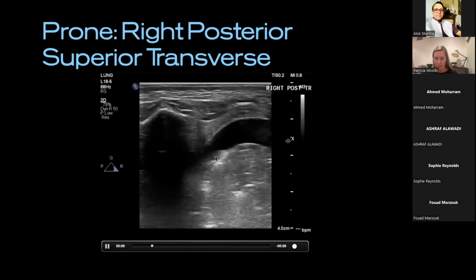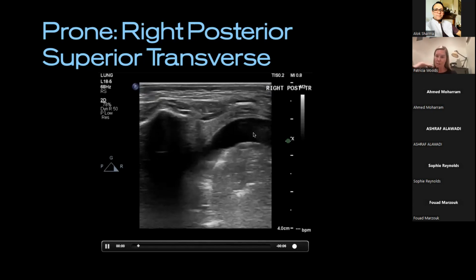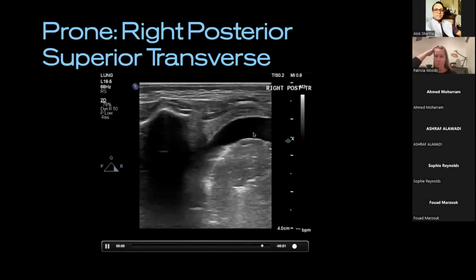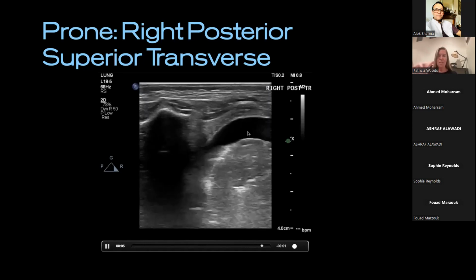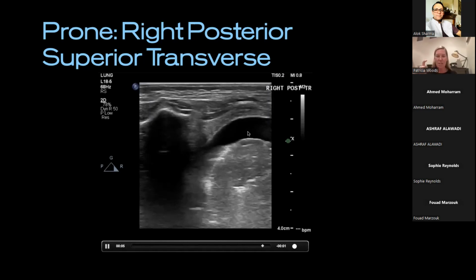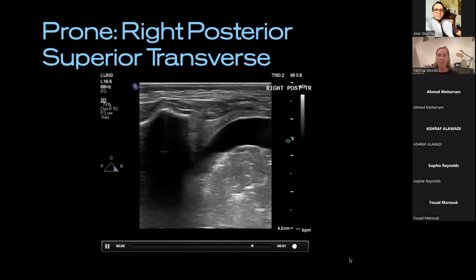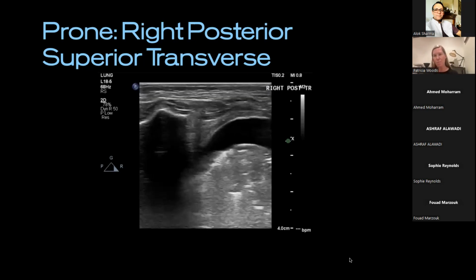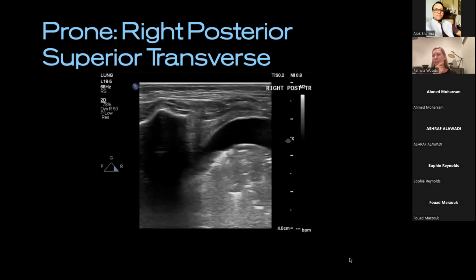So this baby's lying down, and I'm looking at the least dependent area now. And what I think you'll observe here is this right upper lobe of lung bobbing away, suspended in rather a lot of fluid. And remember, this is from the chest, from the head down. Even though it's probably coming out at only 0.5 centimetre, it appears that this is significant for this baby. And it was just the start of the assessment. So I find scanning in the position that your baby's nursed in is probably more helpful than flicking them over and having a sort of rigid rule about how deep it needs to be.